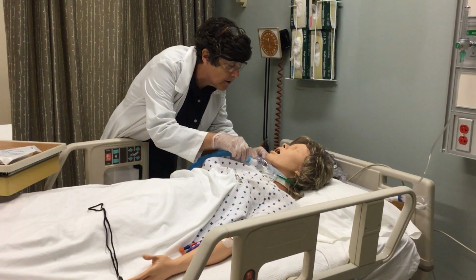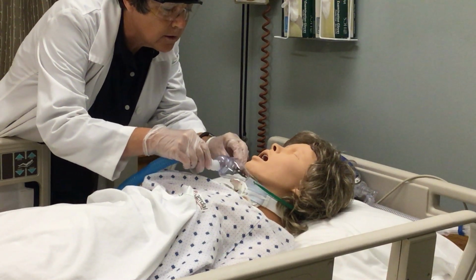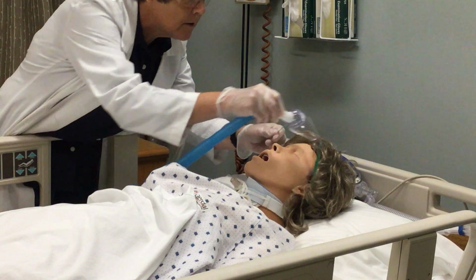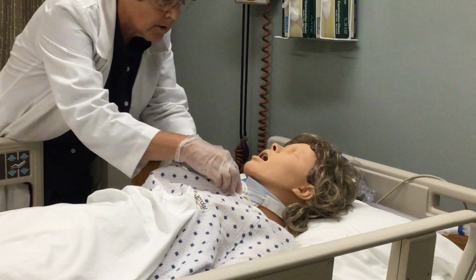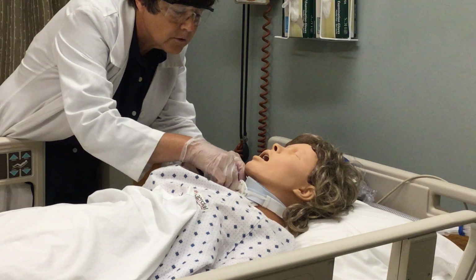I'm also going to take off this trach collar. Normally you would be able to unsnap your trach collar, but this particular trach collar does not have a snap. So I'm just going to go up over her head for today. And I see you have a little bit of secretions on here, Miss Cruiser.